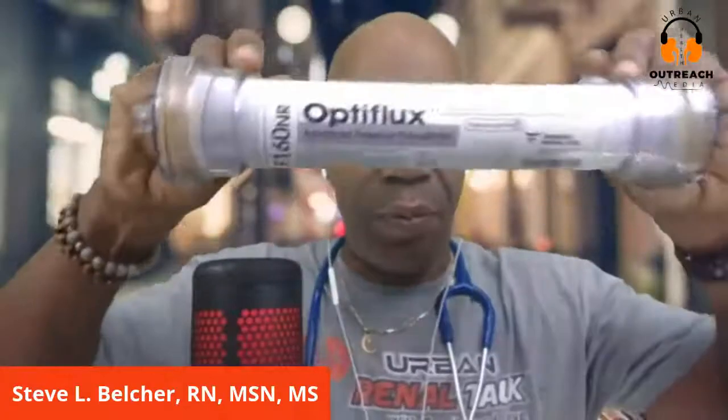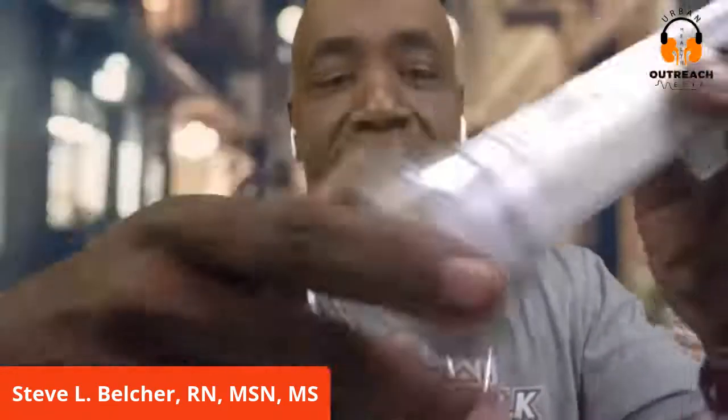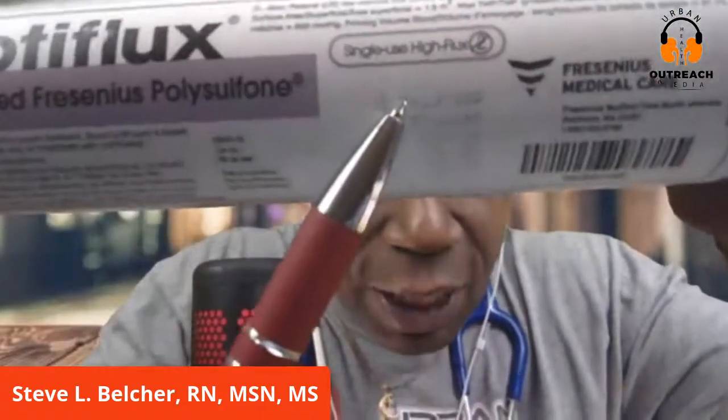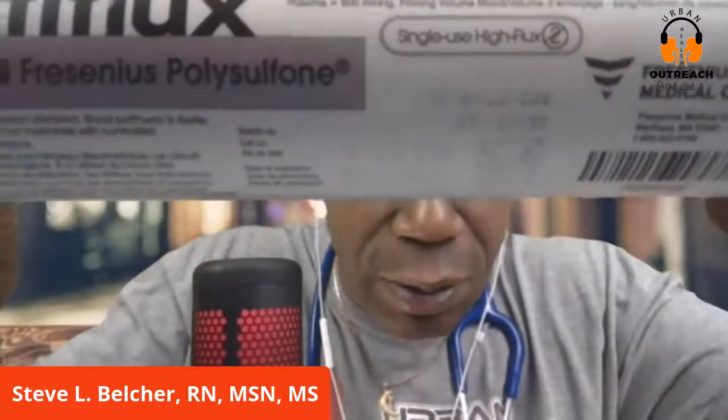Now, I want to show you that. So this is the dialyzer right here. This is an artificial kidney. And actually, this is the Fresenius 160 non-reuse. The reason why I say non-reuse is because our friends over in India reuse these filters. We used to do it, but they did away with it. Single use only. If you can see that. So it's single use only.